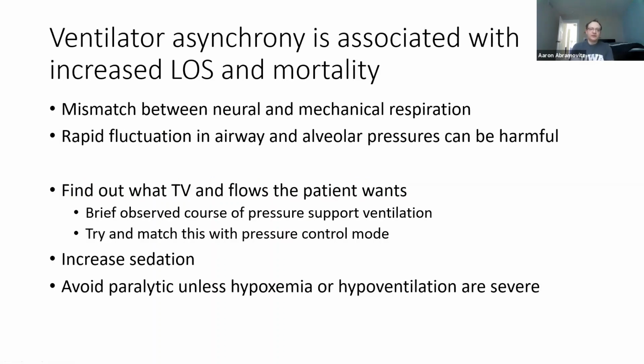Ventilator asynchrony or dyssynchrony are associated with increased length of stay and mortality for all patients, not just ARDS. And what's harmful about it is there's a rapid fluctuation in the airway and alveolar pressures, and it causes very quick recruitment and de-recruitment of places that were previously held open by PEEP, and that can cause shearing to the alveolar units.